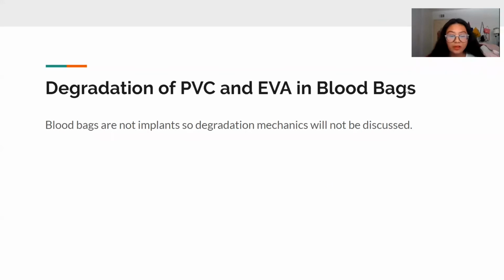EVA does not have plasticizers, so there is no concern of plasticizers leaching from EVA bags. Due to the fact that blood bags are not medical devices implanted inside of the body and are not used for long periods of time, degradation mechanics are not applicable and will not be covered in this presentation.